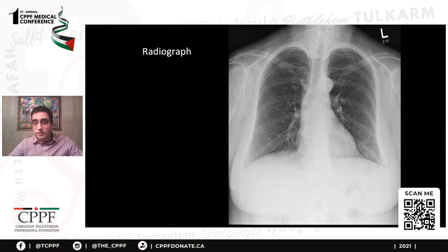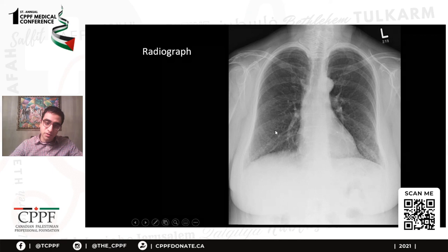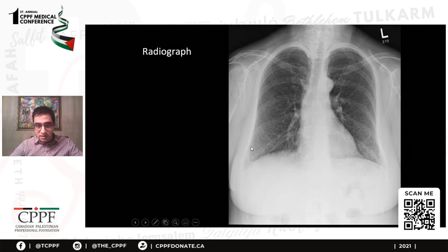You do the radiograph and you see this. So take a few seconds and see if you can identify any of the findings, anything that strikes you the most. All right, so I'll talk a little bit about it as it might not be projecting super well on Zoom. So the most striking finding really is the interstitium of the lung. You see all these small septae and all these darker, almost cyst-like appearances at the bases of the lungs. It looks fairly normal at the apices, but more so at the bases.